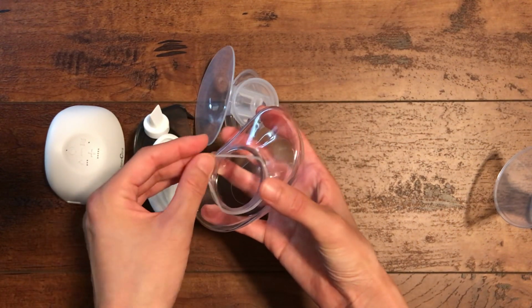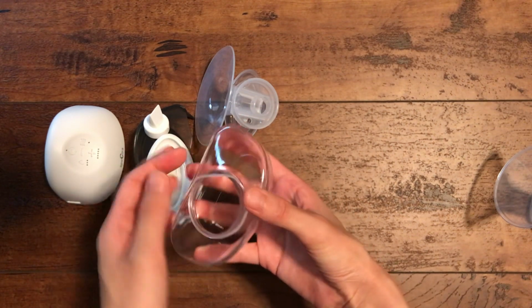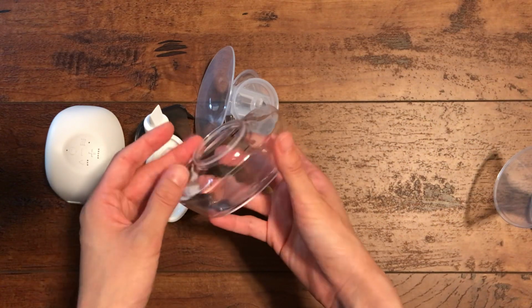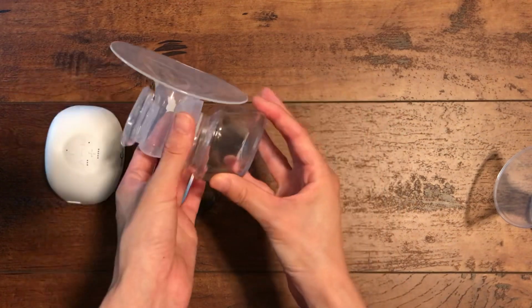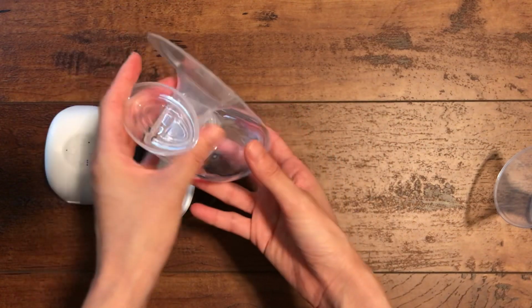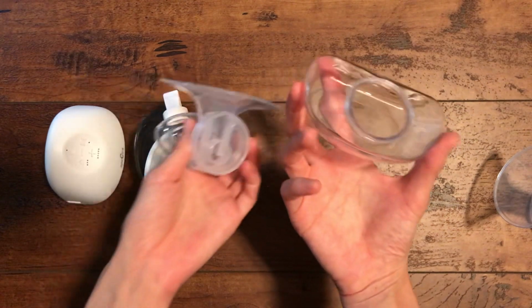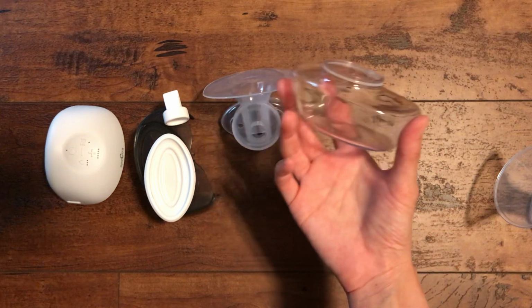Initially I just didn't bother taking this apart. I just dried them as is, and I noticed that with more use, this came off more easily. Like I was holding it and then it would just come off. So it definitely made a difference when I let the ring dry completely.